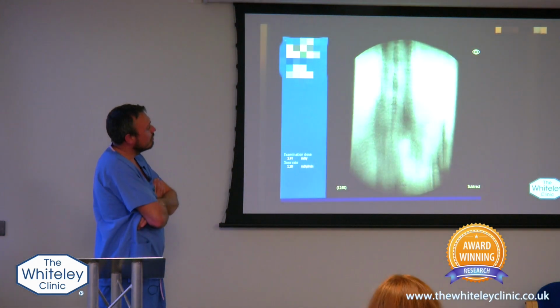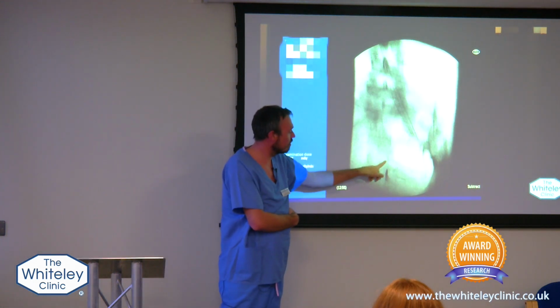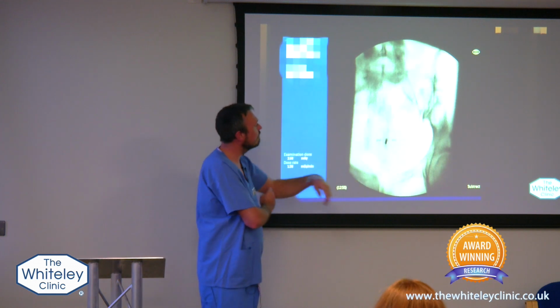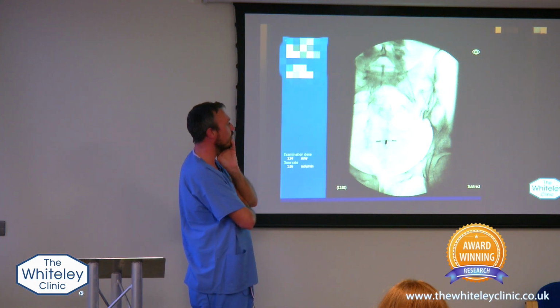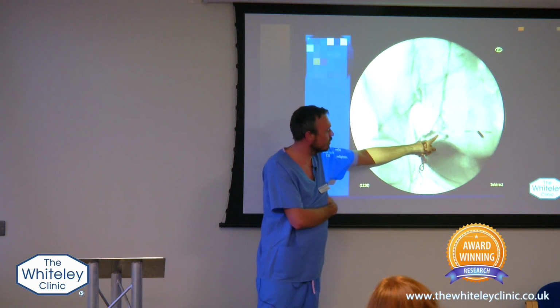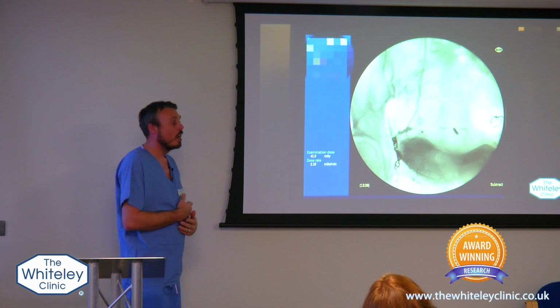And then all we're doing is we just follow the catheter down. This is an intrauterine coil device that's in situ. And then we just use this very, very fine wire and tube. Again, you can just see the tube moving on the left of the screen, and in a second you'll see the tube on the right of the screen. And that's injecting the contrast. That shows where the veins are. That's giving me a map of where I need to go.